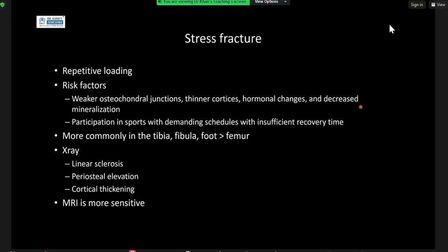And on X-ray, it can be quite subtle. I think you need to consider all the other things you're thinking about, infection, even osteoid osteoma; it's a very important differential. MR would help you to delineate the extent of marrow involvement, and then if you're still in doubt, do a CT for characterization. I think in kids, if you don't find the answer with a single modality and you think that it could be certain other differentials, consider CT. Although there's radiation, it can help you to narrow down your differentials. I'm not saying to do it in every one you don't have an answer for on MRI, but if you have a potential differential, some of which can be excluded on CT, like osteoid osteoma, do it.